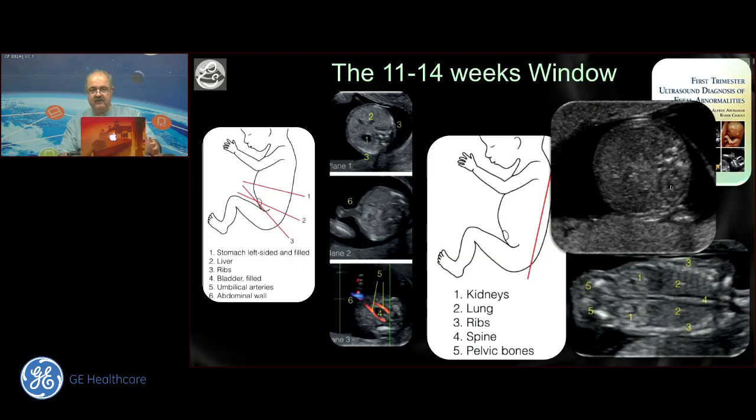If you're using some of the newer equipment, and if you're using harmonic imaging, you will often find that the echogenicity is almost identical, or the kidneys might actually appear more echogenic at this stage. So if you have any doubt, just switch off the harmonics and see what is going on, or use an old-fashioned transducer and see whether they're truly echogenic or not.